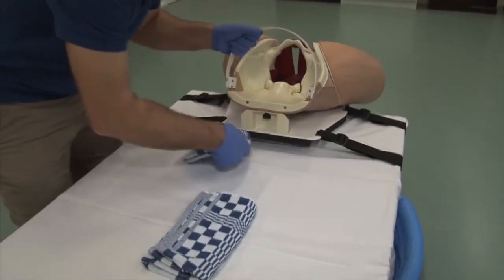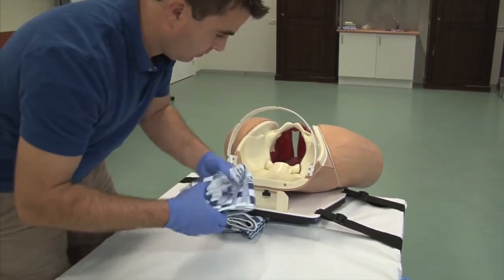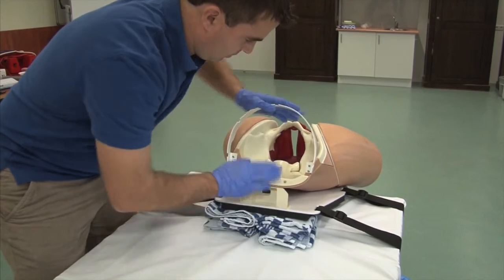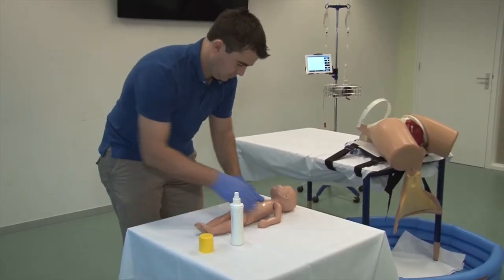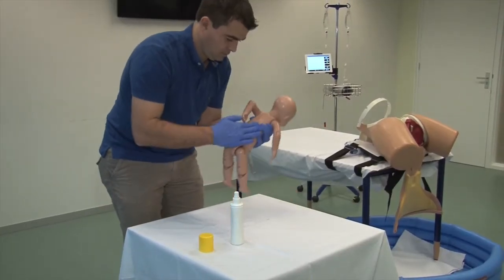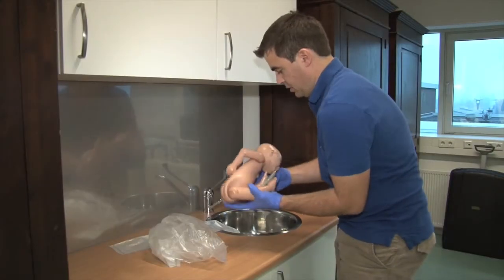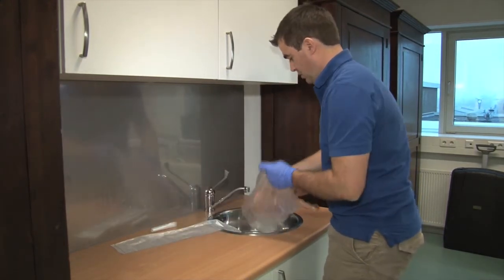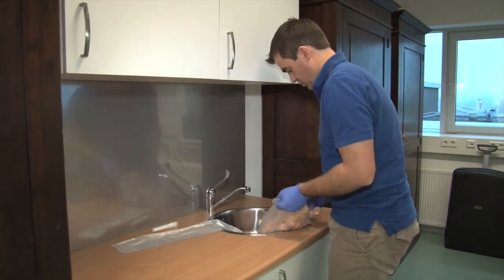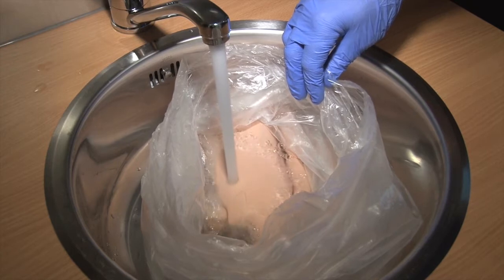In order to protect the instructor from getting excessively wet during the exercise, the pelvic manikin is slightly tilted towards the edge of the table. The fetal manikin is then lubricated with the silicone gel or spray. The fetal manikin is then inserted in a frank breech position into a thin plastic dustbin bag, which is filled with two liters of lukewarm water, in order to mimic intact membranes and amniotic fluid at body temperature.